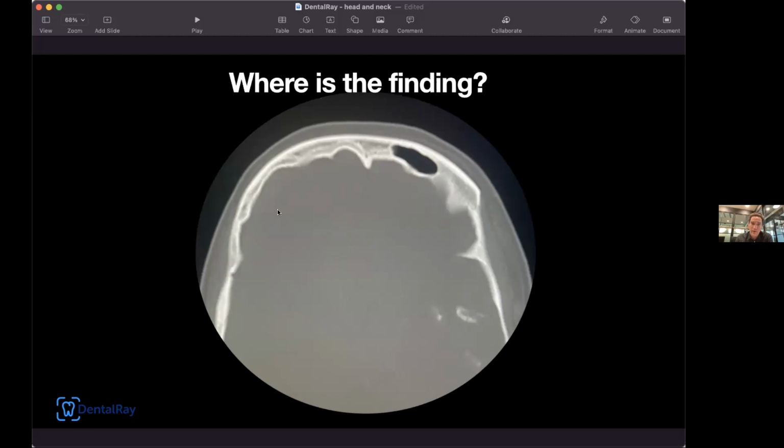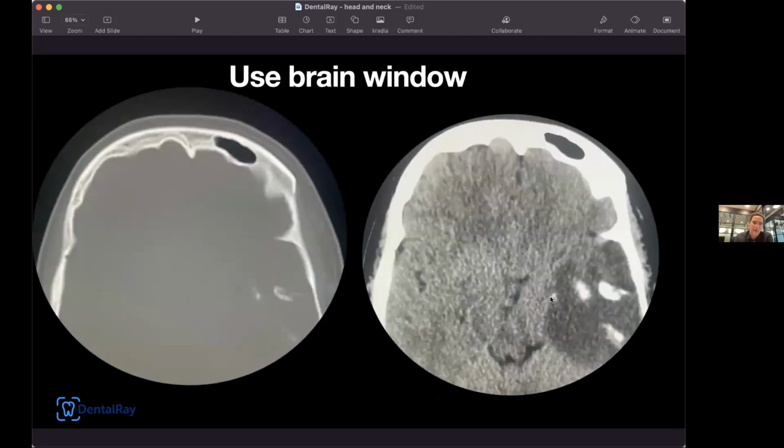This is a bone window again, where we're going to emphasize the outer table, the inner table of the calvarium, and anything that has high density mineralization or calcification is going to look white. So if you're scanning through this image and you're looking in the area of the brain, you hopefully come to this area and think, that doesn't look quite right. We're going to take a closer look at this. So then again, this is where that search pattern and moving to different windows to emphasize different tissues is going to be extremely useful. This is a brain tumor, a large brain tumor in a young patient.